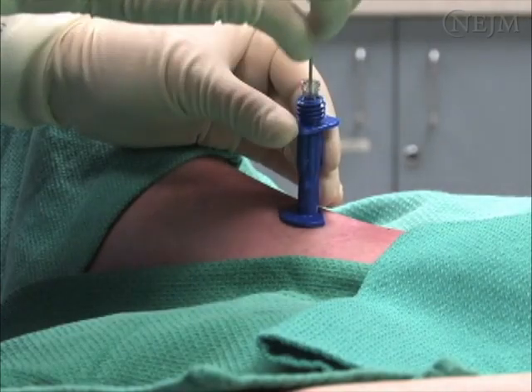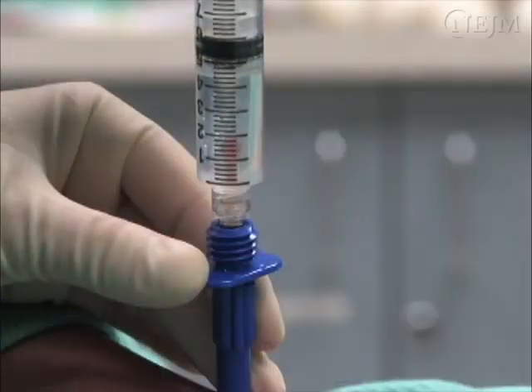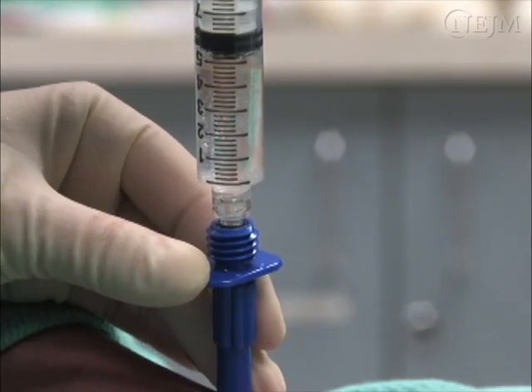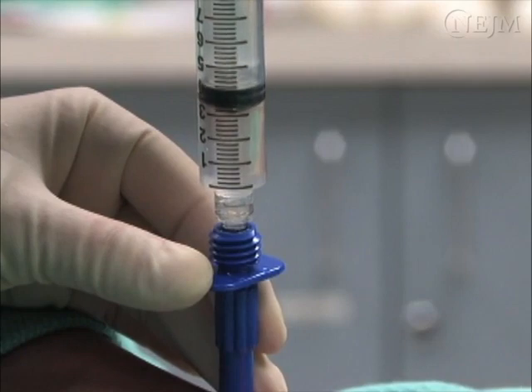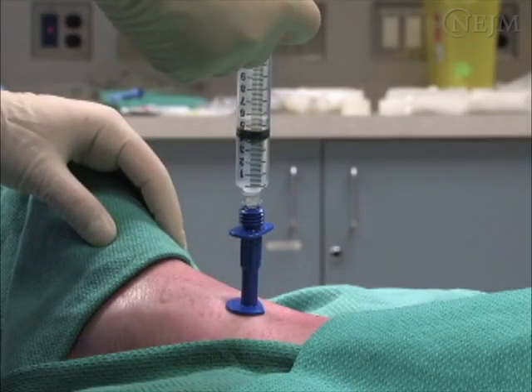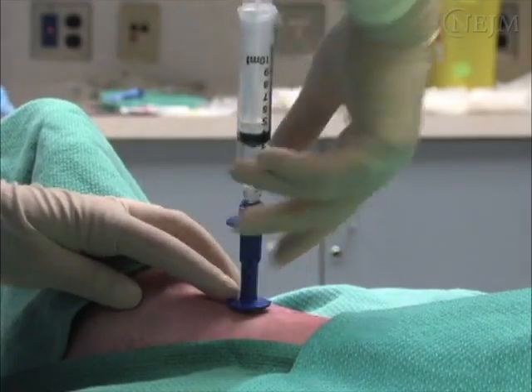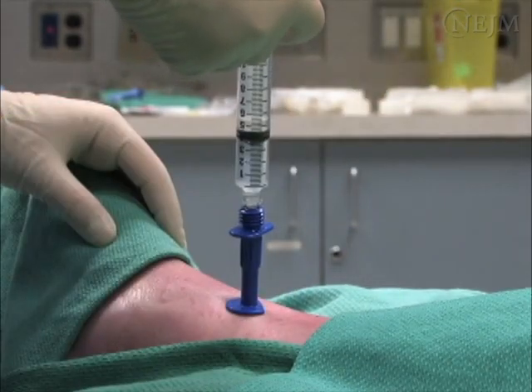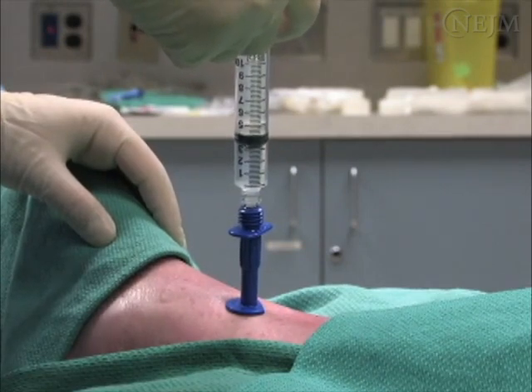Remove the stylet and connect a 5 cc or 10 cc syringe to the needle. Obtain confirmation of placement by infusing a 10 cc bolus of saline solution through the syringe. The fluid should flow easily with no resistance. If the fluid does not flow easily, the needle can be repositioned by pulling back slightly, but if further resistance is encountered, the needle should be removed and a new site selected.